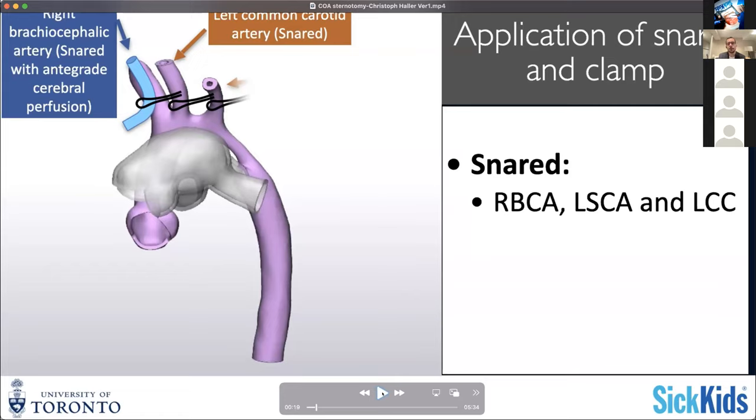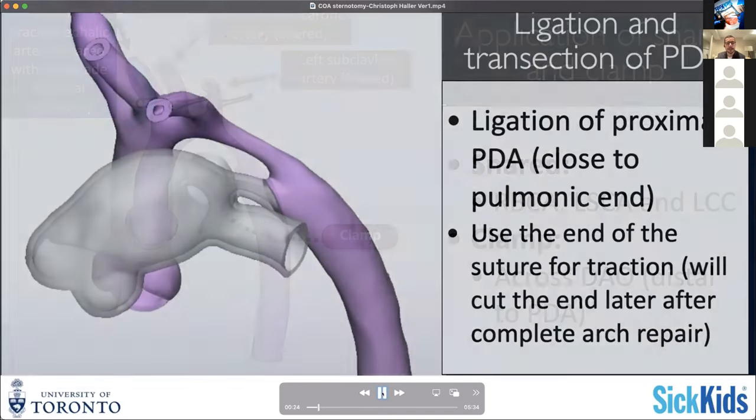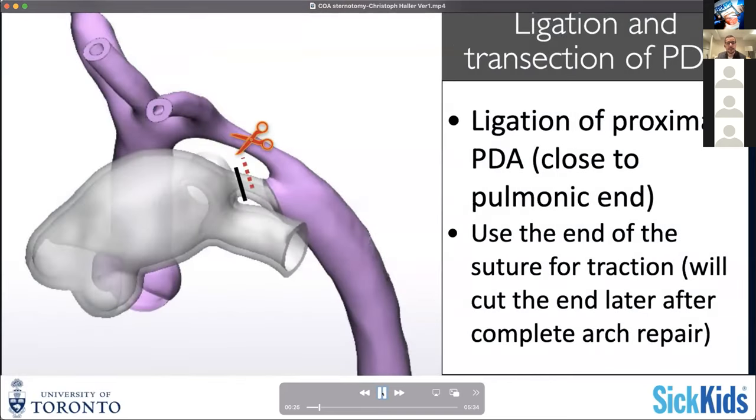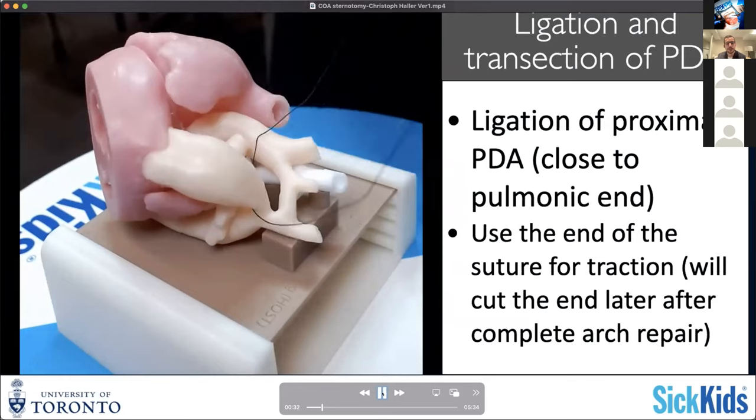Not part of the procedure in the models, but it is something you should be considering when thinking about these repairs - how to basically get to a stage where you can actively start augmenting your arch, and what you need and how you set yourself up to get there. You certainly need control of the supra-aortic vessels so that you can occlude them. Then you can divide your duct and occlude your descending aorta as you start preparing.